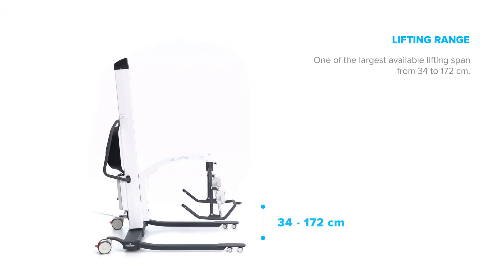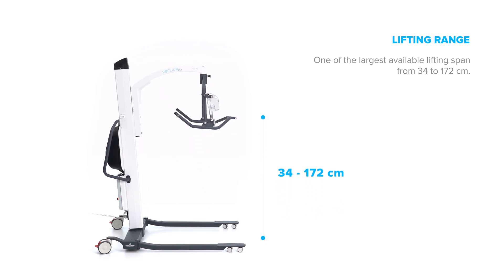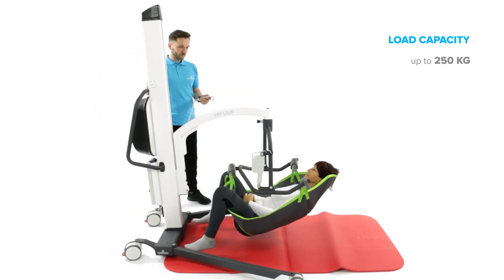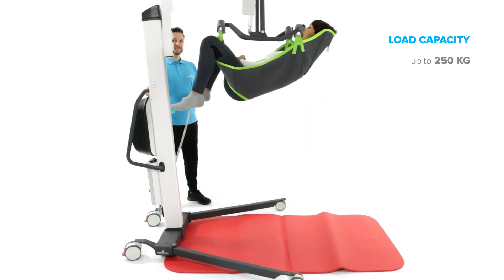One of the largest available lifting spans — from 34 to 172 cm. This very large range of arm movement allows lifting patients easily from the floor or bathtub and transferring them even to a high bed.